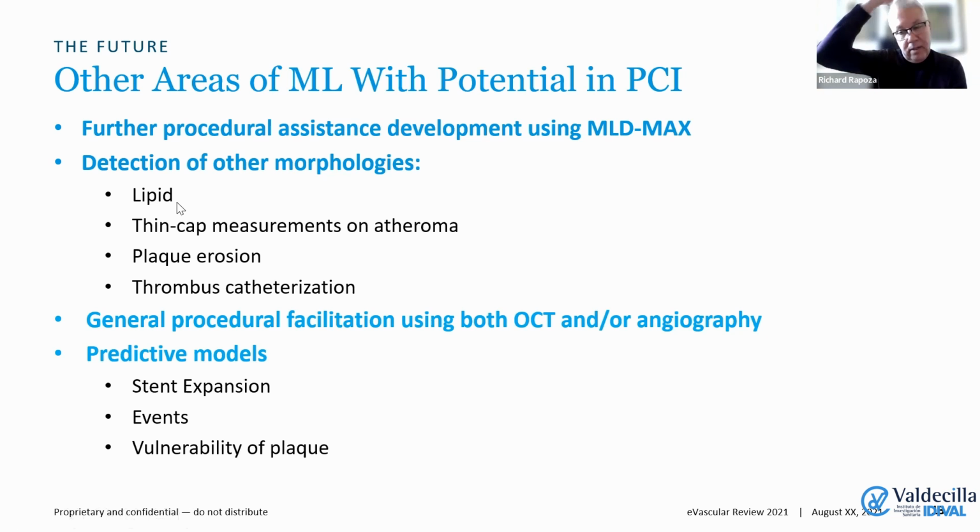It's interesting, though, in contrast to the previous presentation, that if you have chemical information that tells you this is a specific type of lipid that is more dangerous than any general lipid, it will be extremely useful. But in general, since lipid appearance on OCT is fairly uniform, we can tell it very easily from calcium. And calcium and lipid tend to occupy the majority of what you see in terms of morphology in vessel walls.